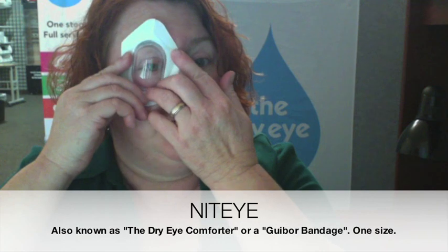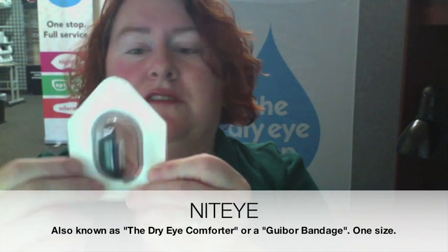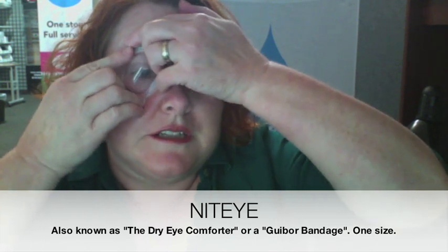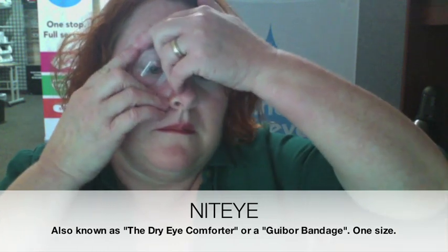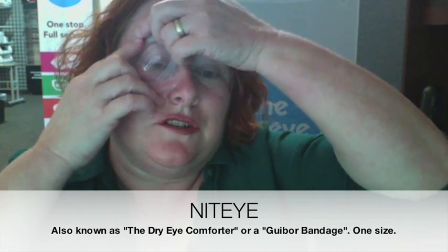They're pretty sizable and they work pretty well as a one size fits all. You can take a pair of scissors and trim down that flange if you need to. Here's what it looks like going on. Just make sure you're getting it sealed all the way around. I used this one once before so it's not as sticky as it should be.